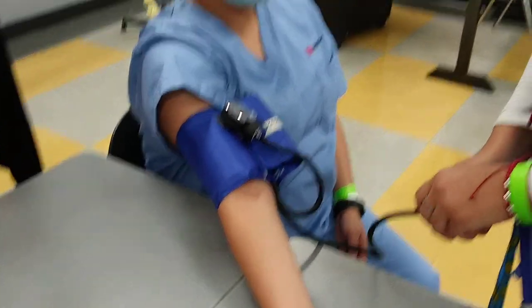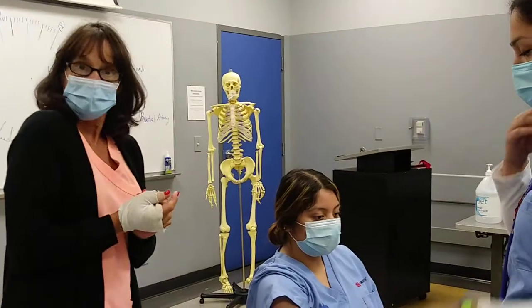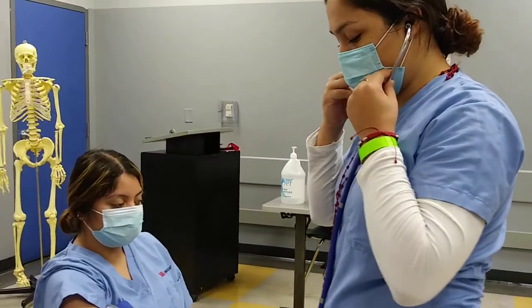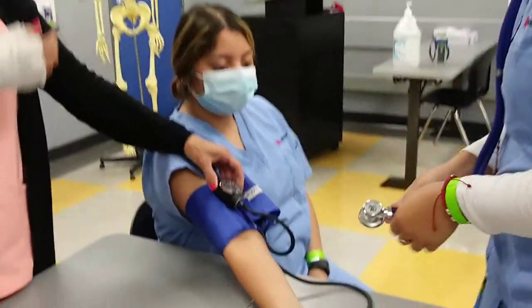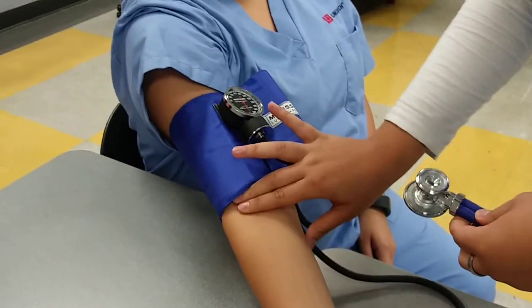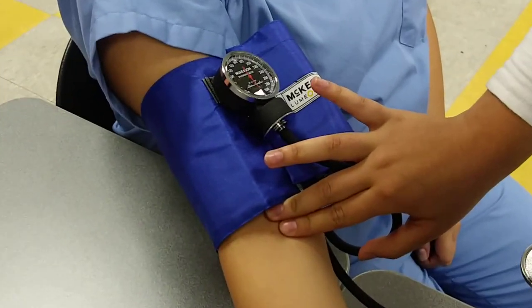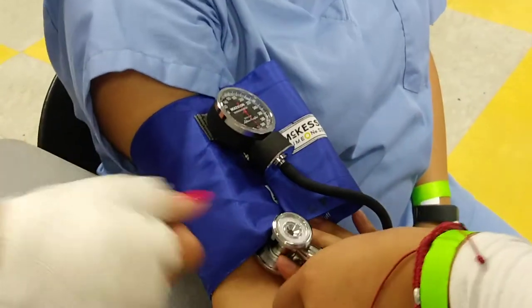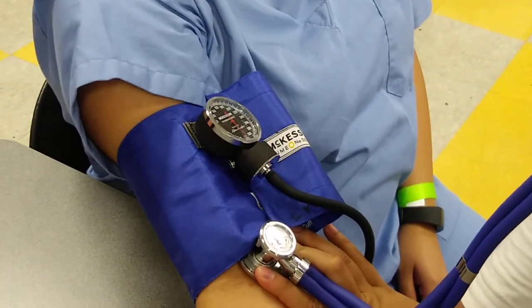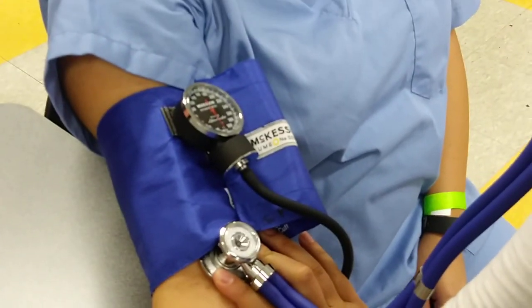So what was the peak? I got 100, so I'm at 30, so 130. Okay, so she got 100, she's going to add the 30. She knows to pump this patient up to 130. She's tapping on her stethoscope, feeling for the brachial pulse. Perfect. She knows not to put her thumb on this bell because she will hear sounds that aren't part of the blood pressure.